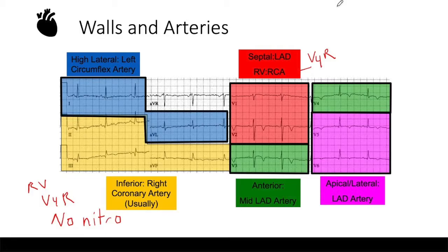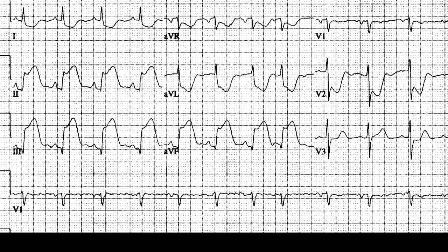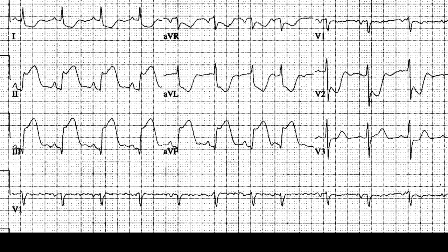Now let's look at some examples. Whenever I'm looking for ischemia, I read the EKG from top to bottom, left to right — always starting with lead 1 and ending with V6. The way we determine an ST depression is to draw a line from the PR interval to the next PR interval to get a baseline. If someone has a one small box deviation of the ST segment below that line, they have an ST depression; above the line is an ST elevation. For ST elevations in the precordial leads, they need two small boxes of elevation; in the limb leads — 1, 2, 3, AVR, AVL, AVF — you just need one small box.